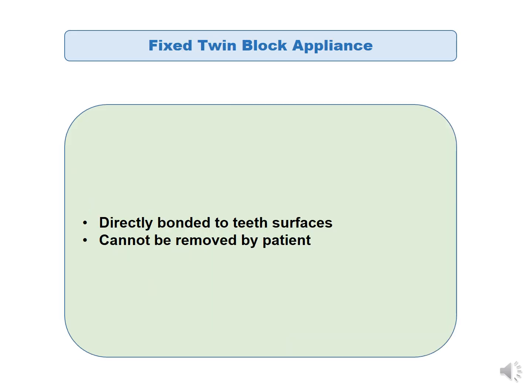The twin block can also be modified into a fixed twin block, whereby the appliance is directly bonded to the tooth surfaces and cannot be removed by the patient.